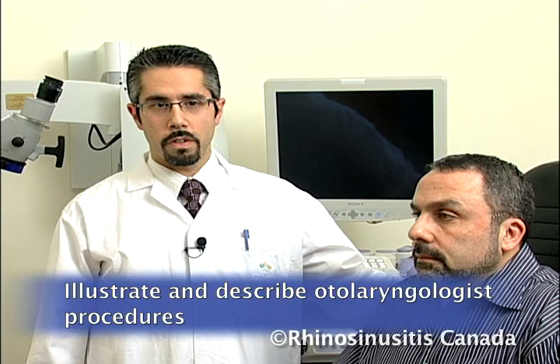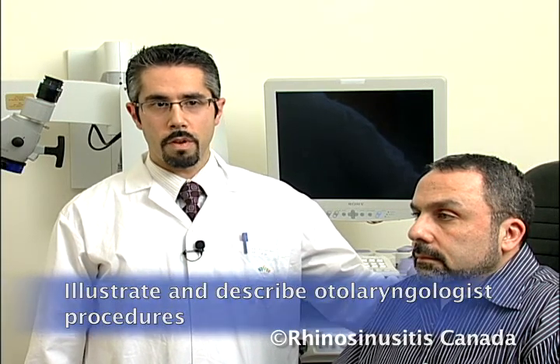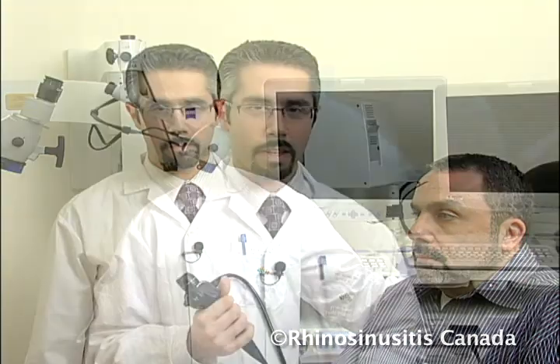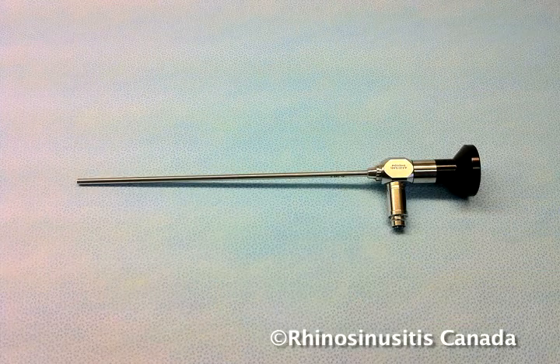We will also illustrate and describe some procedures that the otolaryngologist might use if your patient is referred for assessment of their sinonasal complaints. When you refer your patient to an otolaryngologist for their persistent nasal or sinus complaint, they may be examined with either a rigid or a flexible endoscope.